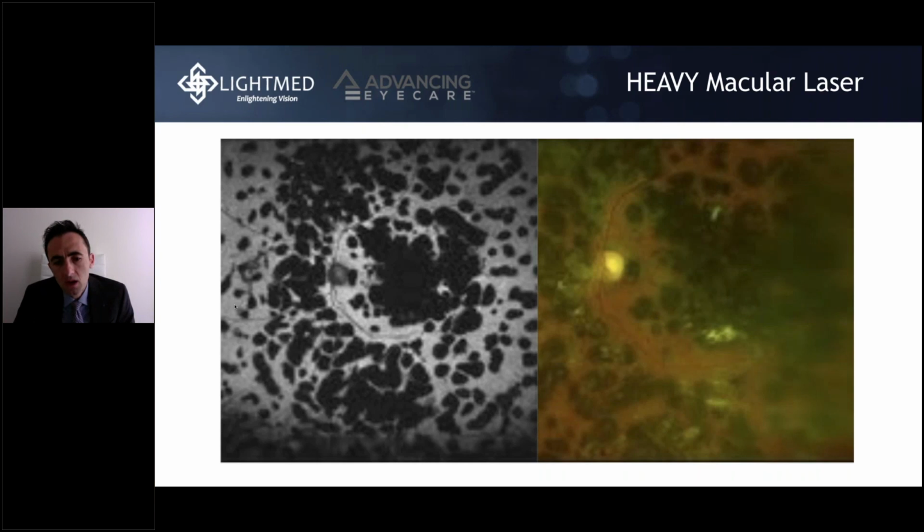I definitely utilize the yellow laser with SP-Mode right now for all of my focal laser treatments, unless it's a huge solitary microaneurysm that I just want to target with a traditional focal laser, and I just do it. And also, the patient's tolerance is pretty good for these yellow wavelengths. No pain, no discomfort. They like the treatment. They go home. They just go back to whatever they were doing, and some of them can even go back to work after the treatment sessions.